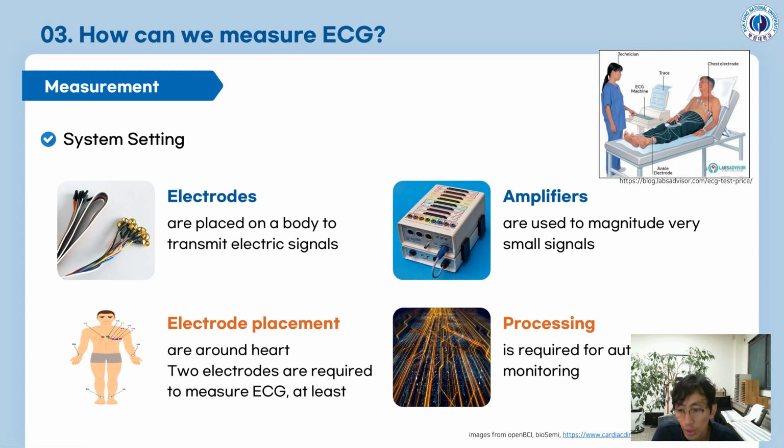If we don't put the electrodes on our body, then it's difficult, right? And also we need a kind of paste to get the signal without noise.